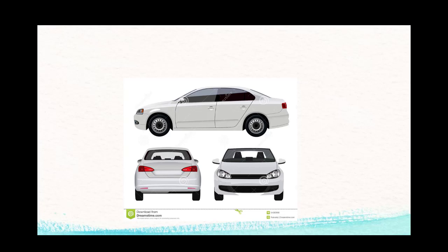Okay, so when we're looking at different leads, we're looking at different parts of the heart individually. And just the same as if we looked at a picture of different parts of the car. So it gives us a picture of different ways that we can perceive and look at the heart.